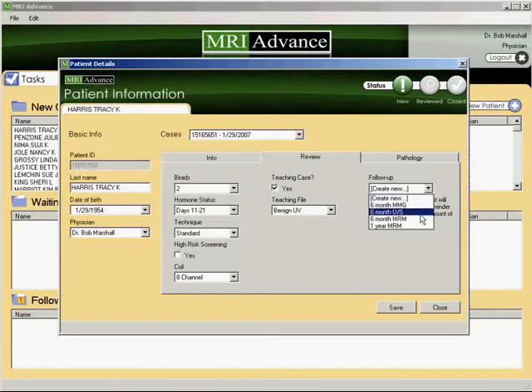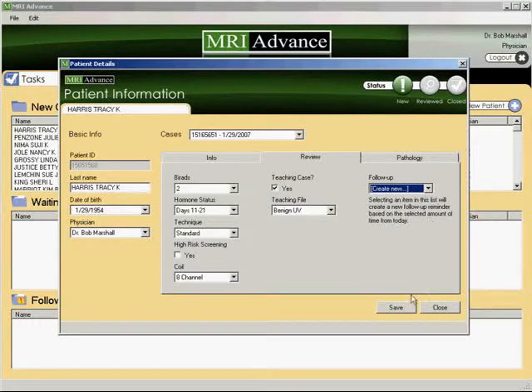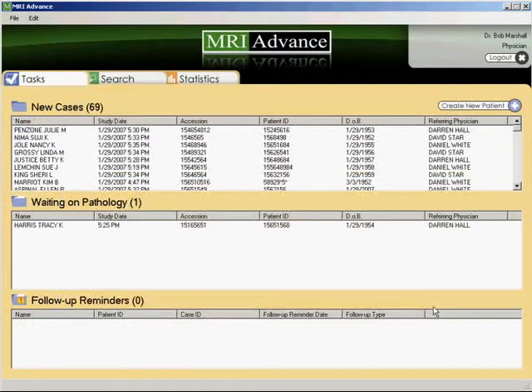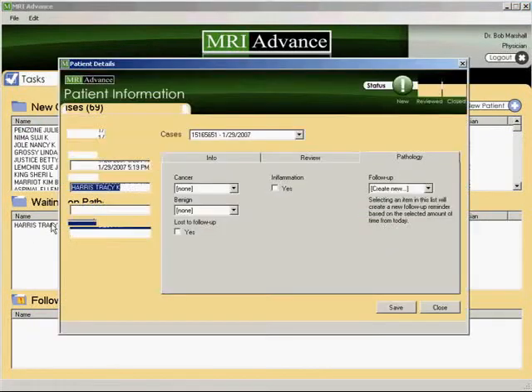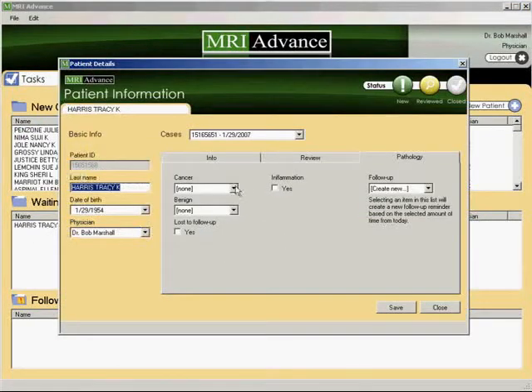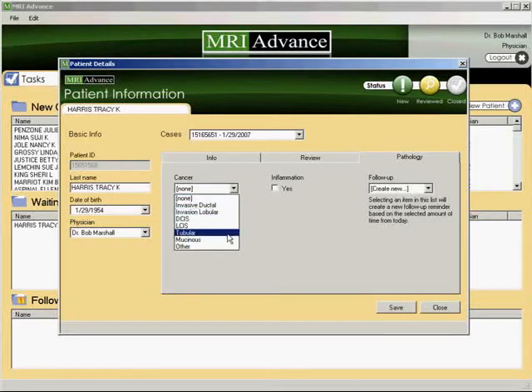The patient data section displays the patient demographics, as well as a series of pull-down menu options. The minimal data which should be entered is the BI-RADS codes for the MRI interpretations. Multiple other parameters, however, such as phase of the menstrual cycle, technique, or coil used, as well as several other parameters, can also be entered and then sequentially evaluated as to their impact on your results.